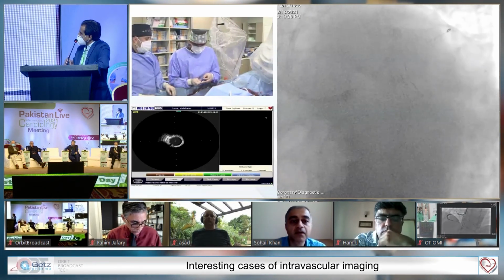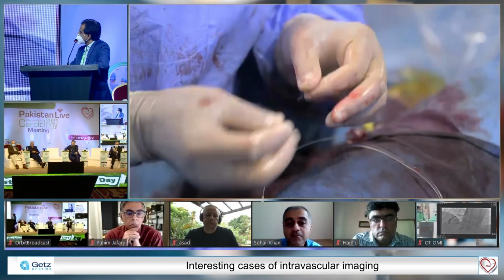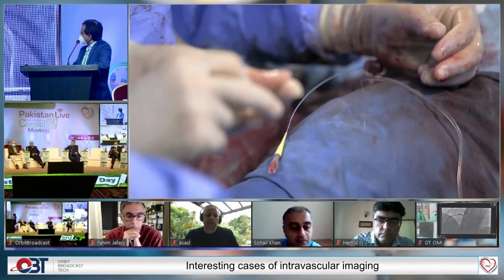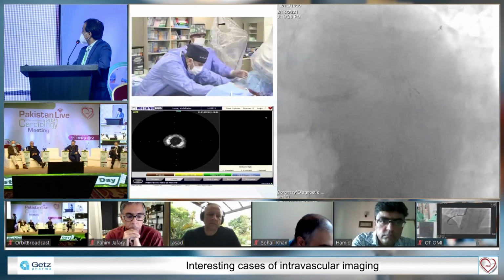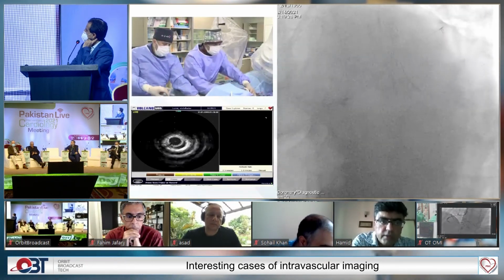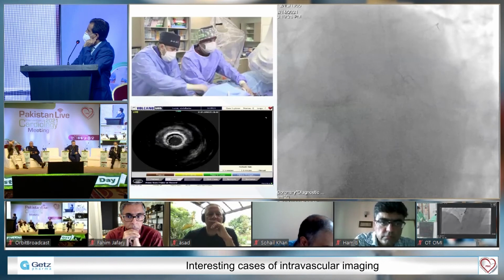Dr. Goktigan, we have 7 minutes of transmission left. Okay. What size balloon are you using for POTs? For the proximal, I like to use 4.0 if it is possible. Let's see what IVUS says. Otherwise, I will do exactly what I do: 3.0 and 3.5 for post-dilatation of the stent.